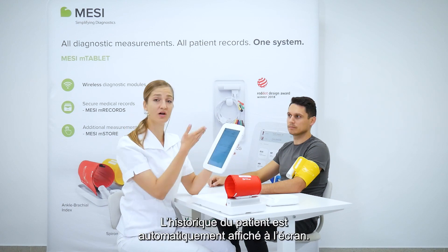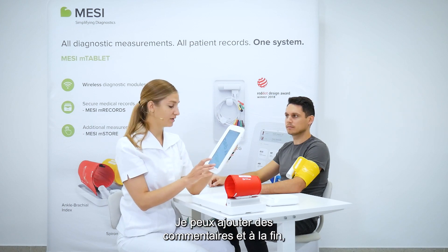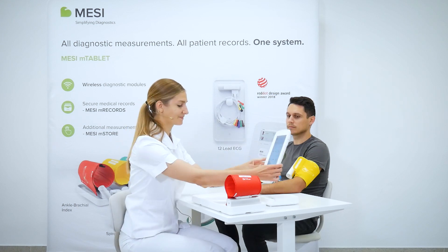The patient's history is automatically shown on the screen as well. I could add any comments, and when I'm done, this measurement is automatically stored into the patient's healthcare record.